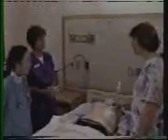Many hospitals have chosen the ZOLL PD 2000 and made it available wherever automated external defibrillation may be needed. If all the defibrillators in the hospital are similar, personnel can become familiar with one type of device. These ZOLL PD 2000 devices are kept in the patient care areas and maintained in a ready state with daily inspections by designated personnel. The defibrillators are set up with the self-adhering stat pads electrodes attached.